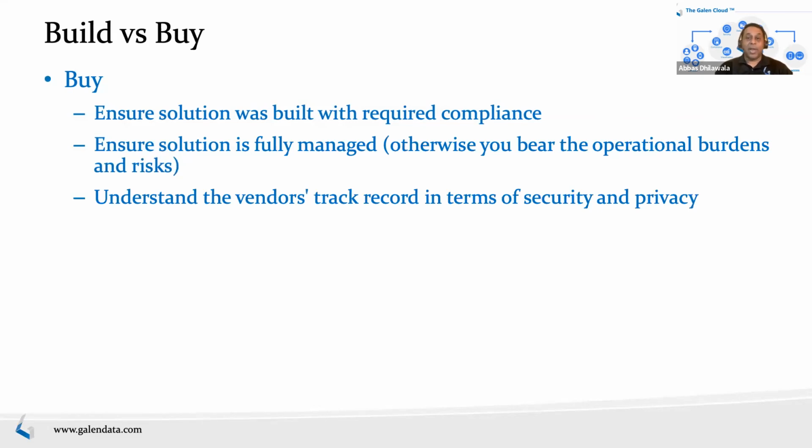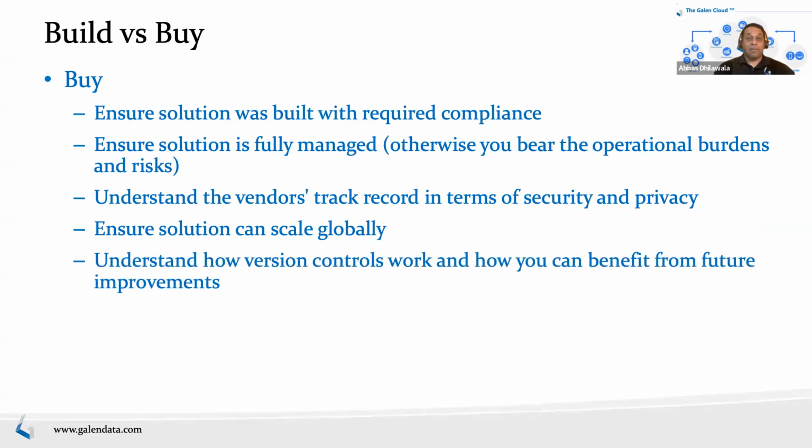If you have aims of being global, make sure that vendor solution can also scale. Otherwise, you run into different solutions across different geographies, which can become very complex. And then understand how version control works. If they have a solution that is updated, how do you control those updates, and what do you do when the updates happen? So understand all that mechanism as well. It's important to understand that from the get-go, before you make a decision to buy.